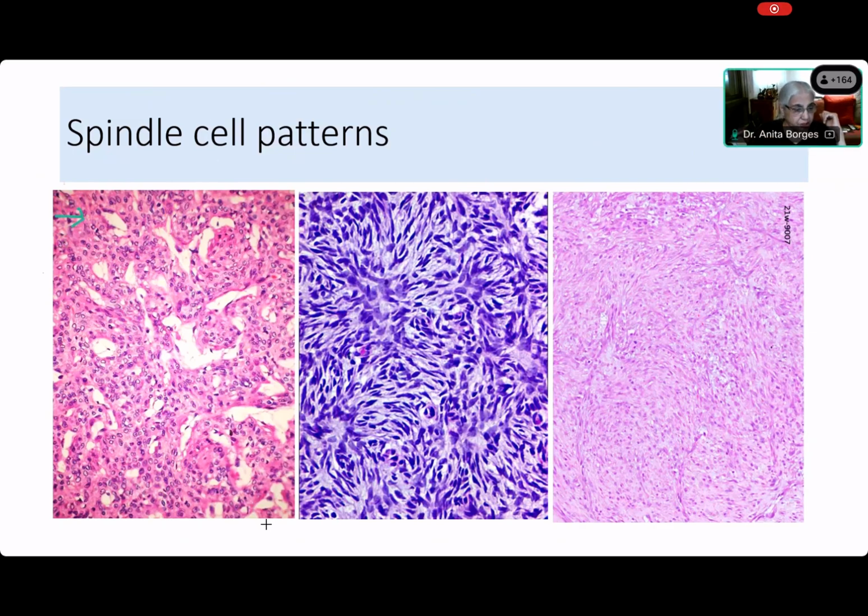No, Kedar is having difficulty. Shashank, what is this pattern that you see in this left-hand side thing? There are people in the chat box answering. All right, Chandana. Yeah, Chandana. No? Okay. Diksha. Ma'am, hemangiopericytomatous pattern. Yes. And this is not correct. Diksha, is it the spindle cell that's forming this pattern or what is forming the pattern? Ma'am, vessels are branching in the staghorn like that.